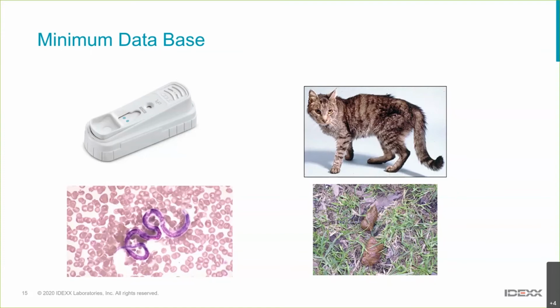I've got a picture there of a SNAP CPL test, and I'm going to be very upfront with you. Clearly, doing this presentation, I work for IDEXX, but the CPL and FPL, the pancreatic lipases, they're not perfect tests. The truth is, we don't have a perfect test for diagnosing pancreatitis, but the CPL and FPL are our best serum tests for looking for pancreatitis, and we can use those in concert with the other blood results, the clinical signs, what we might find on imaging like an ultrasound.